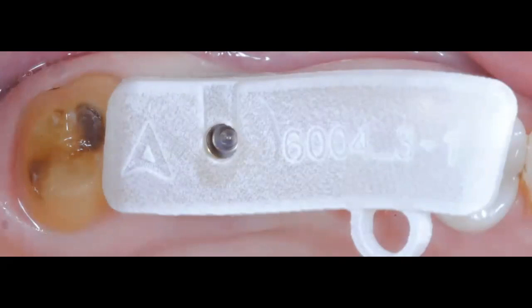This is the actual little guide that is sent from Atlantis to us with our abutment, with our custom abutment, so that makes it a lot easier for us to sit this abutment into the patient's mouth. You just put this little guide that carries the actual abutment in the patient's mouth. It'll sit directly into the implant, and then you can have a screwdriver and go ahead and drive and torque that abutment in. What I like about this little guide that is actually sent by Atlantis is that it makes it a lot safer for us to sit this abutment in the patient's mouth, having less risk of dropping something in the patient's mouth. So having more control of the actual abutment.